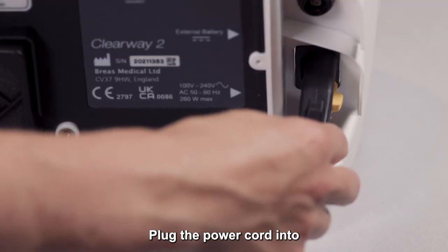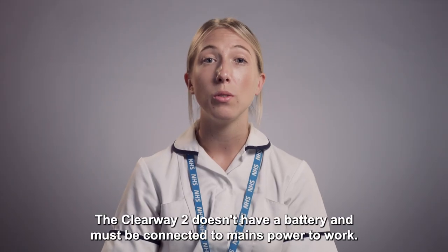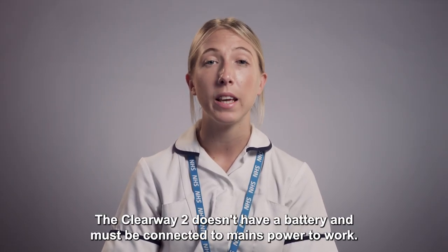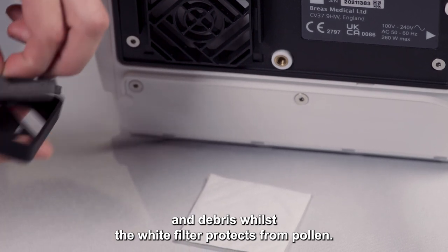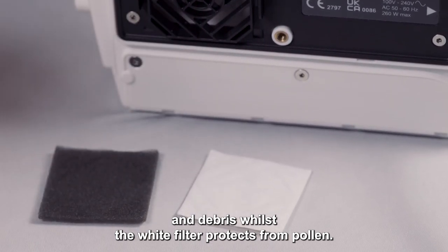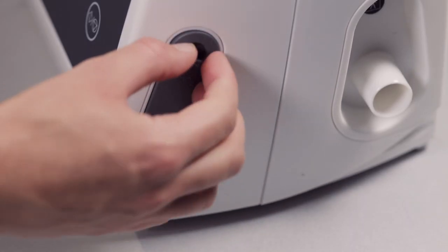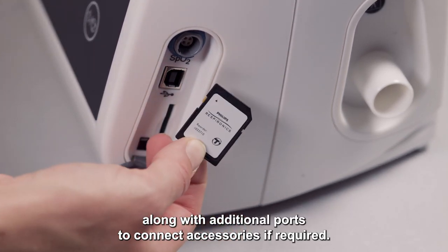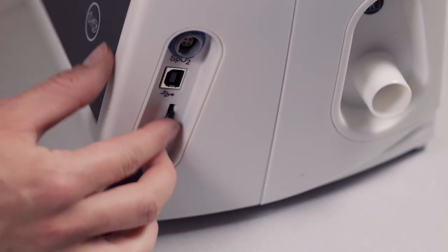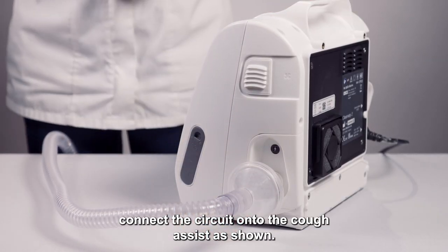Plug the power cord into the back of the device and into a mains power outlet. The Clearway 2 doesn't have a battery and must be connected to mains power to work. The grey sponge filter protects the device from dust and debris, whilst the white filter protects from pollen. Please avoid covering or blocking the filter. An SD card can store data along with additional ports to connect accessories if required. To set the device up, connect the circuit onto the Cough Assist as shown.